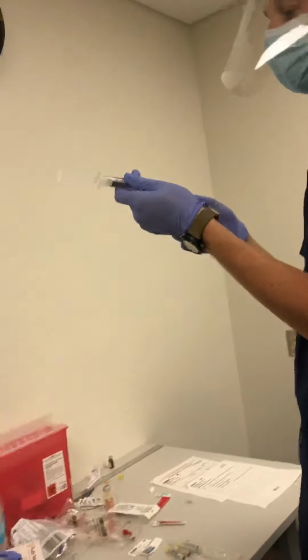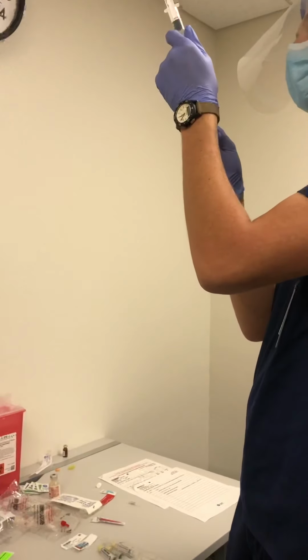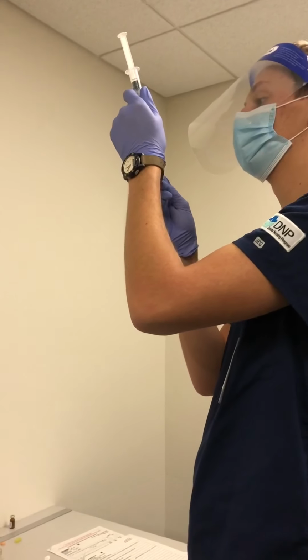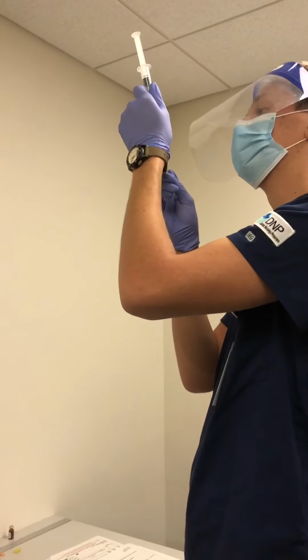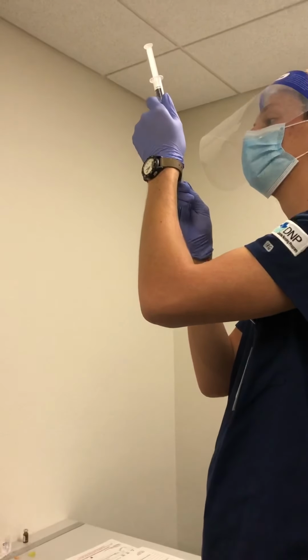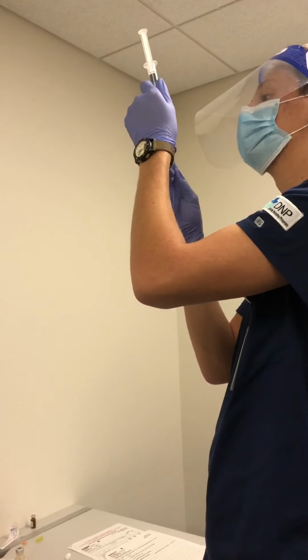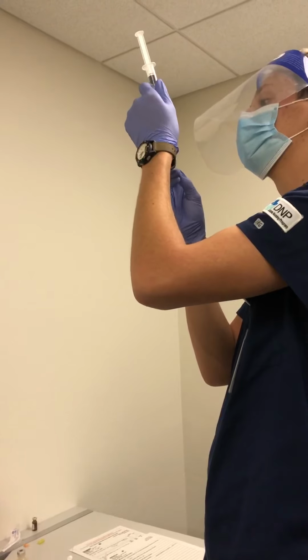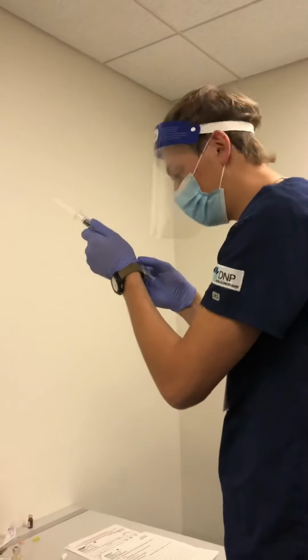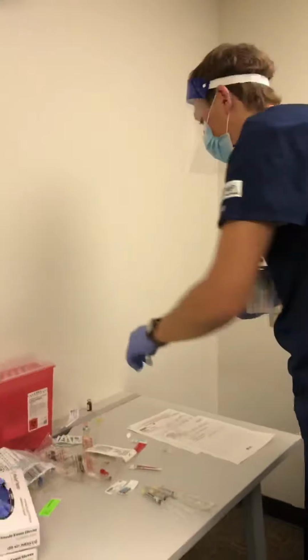And then I'm going to instill 1 mL, so I should be at 1.4. Make sure to get all the air bubbles. There's 1.4. And then that can be discarded.